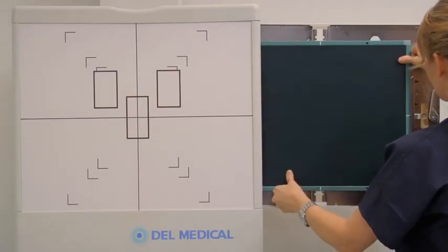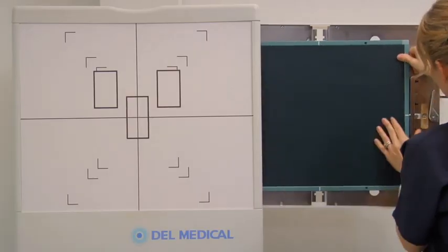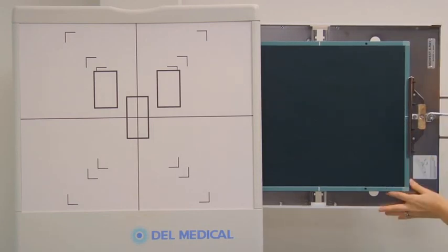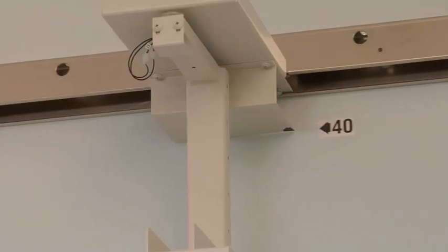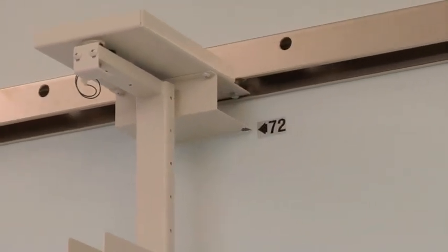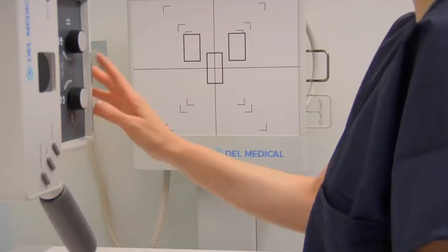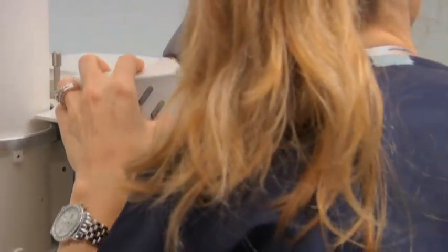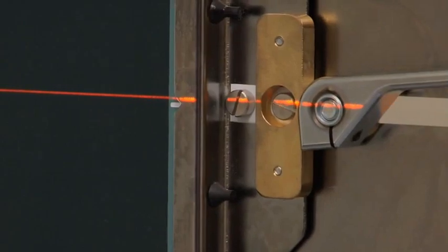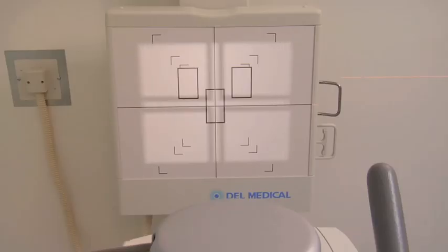To obtain a radiograph of the chest and the PA projection, select a 14 by 17 inch cassette and orientate it crosswise in the upright bucky. Proceed to set the source to image receptor distance, or SID, to 72 inches. Turn on the collimation light and align the central ray to the center of the image receptor. Collimate to the cassette size.